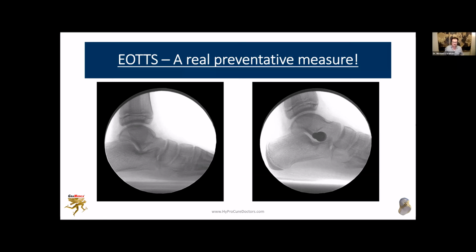So it's something to consider because, again, we're treating the underlying etiologic factor of metatarsus primus varus and hallux abducto valgus. So now when these children have juvenile HAV, and we take a look at the x-rays, we see how the talus is not aligned on the calcaneus, and there's just, again, no way you could even consider prescribing a foot orthotic for this patient and really sleep at night, knowing that you've done justice to this patient. You haven't. It's a subtherapeutic form of treatment.